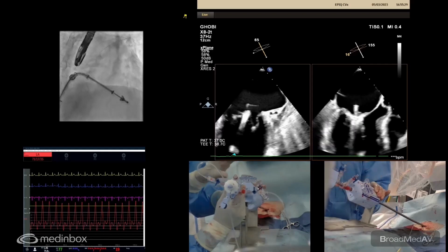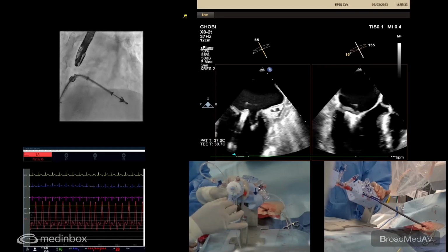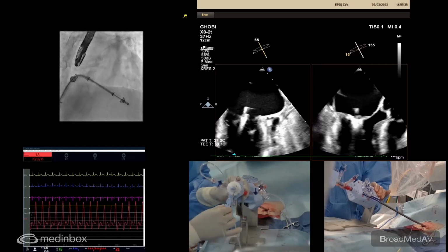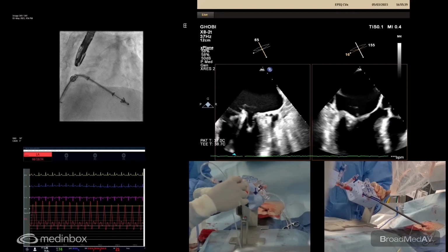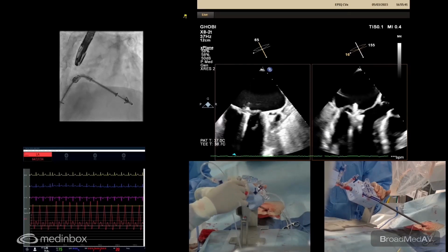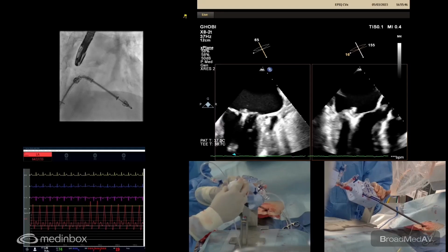Stay like this. Nice. So it's really got it. Yeah, you got both. They're deep in. And so there, I'm going to drop it. And I've got the anterior and posterior in. Good bounce. Good bounce. Now you can see the V waves are very high. And I'm going to lock it and start closing the clip.